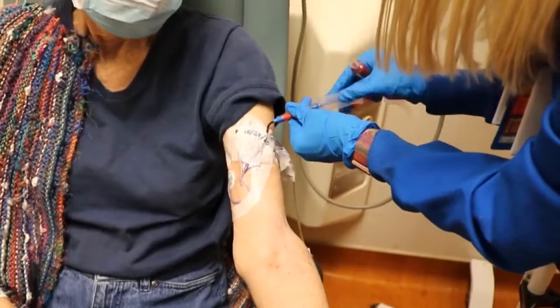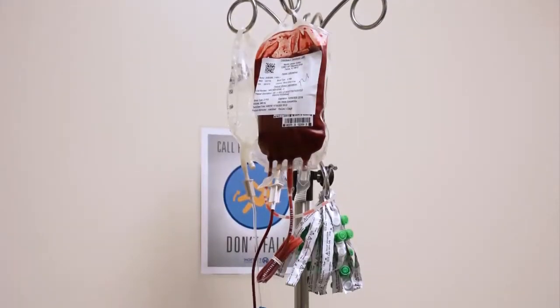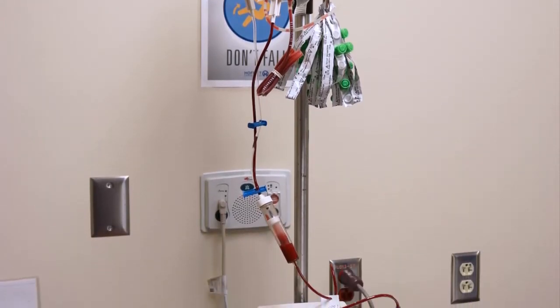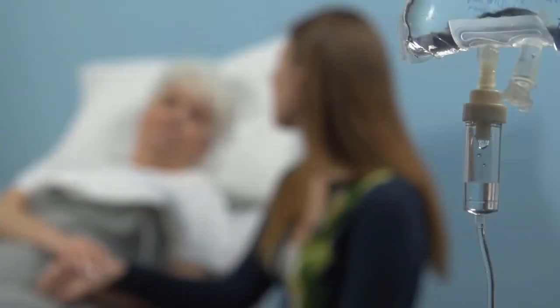A PICC can be used for drawing blood, receiving blood transfusions, receiving IV medications such as chemotherapy and antibiotics, IV fluids and nutrition, and receiving IV contrast during imaging studies.